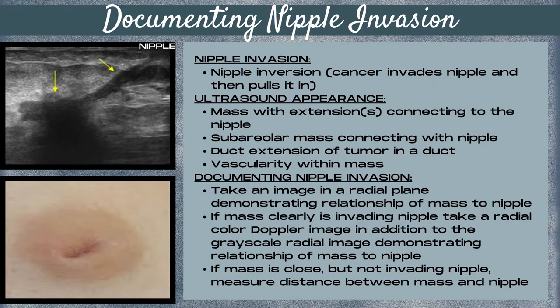The ultrasound appearance of this is either going to be a sub-areolar mass that's contiguous with a nipple where you can't distinguish the border between the mass and the nipple, or you're going to see a mass that has extensions connecting it to the nipple — spiculations like in this top image — or you're going to see a mass in a duct with a duct extension pattern, meaning that the branching portions of the mass within the duct are extending towards the nipple.